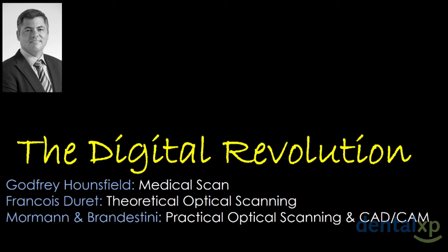This digital revolution is not new. Don't think that you're being exposed to new stuff. As I show you the technologies, you're going to see that these technologies are 2 decades, 3 decades, 4 decades old. It started with the work of Godfrey Hounsfield creating the medical scan, then with the theoretical work of François Duret in France when he did his thesis to obtain his dental degree, and he created a theoretical approach to optical scanning, which was then adopted by Mörmann and Brandestini, creating practical optical scanning, computer-assisted design, and computer-assisted milling.